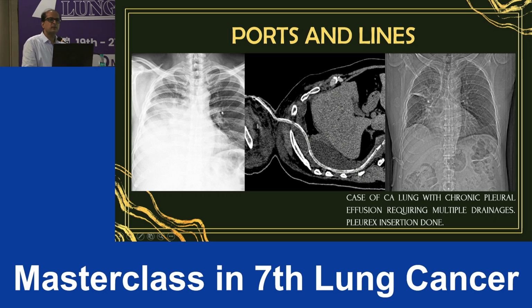When the patient is having malignant pleural effusion, refractory pleural effusion, the patient needs to be tapped regularly. That is the time we can place a Pleurx catheter. So this is a Pleurx catheter. The patient can go home with this catheter, and can be counseled that they don't have to come to hospital. They can be taught how to remove the sample.